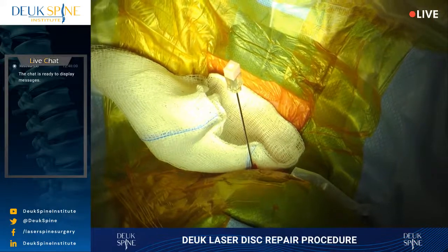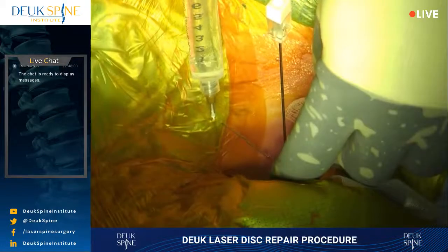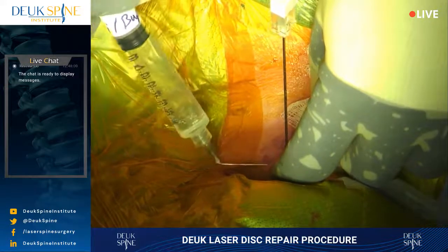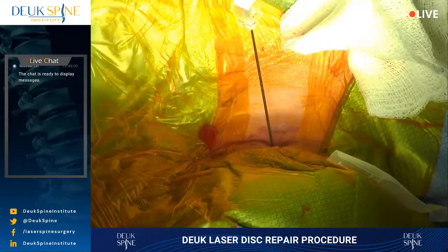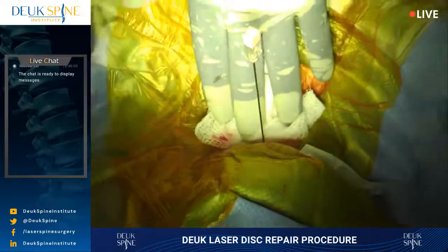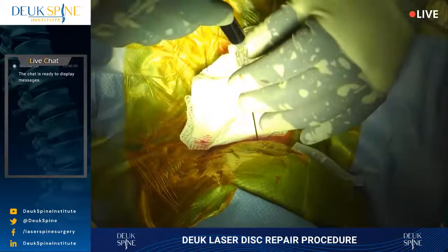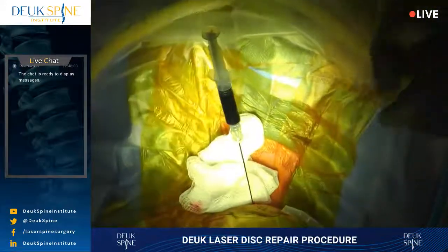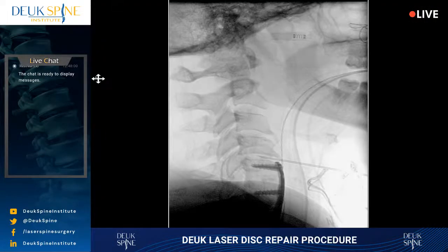Why do we use local? Because it's hemostatic. It actually has epinephrine, right? And it stops any kind of little bleeding in the skin. Plus, it also reduces pain with the incision, because we are going to make a scalpel incision here. Even though it's a small incision, it's still an incision, and incisions in the skin do cause pain. Even though you're not awake, subconsciously you feel the pain, and your body responds with increasing heart rate, increasing blood pressure, which we really don't want those kind of fluctuations. So even if you're just doing a skin incision with a patient asleep, we still do local. So that reduces the amount of stimulation to the cardiovascular system.